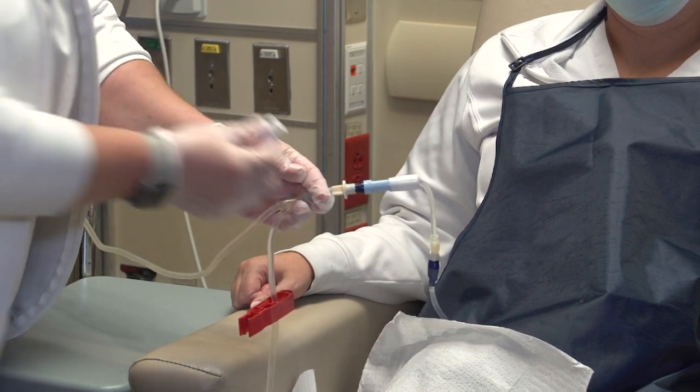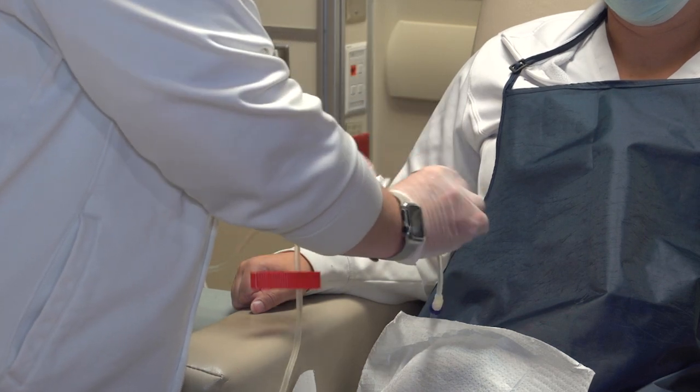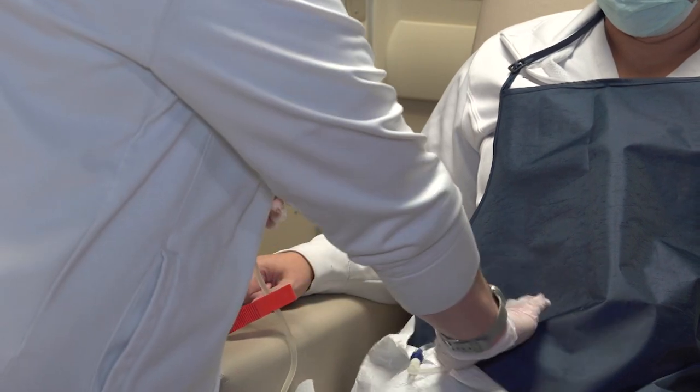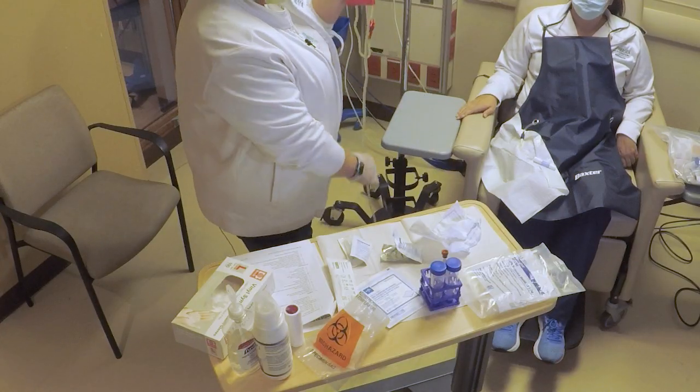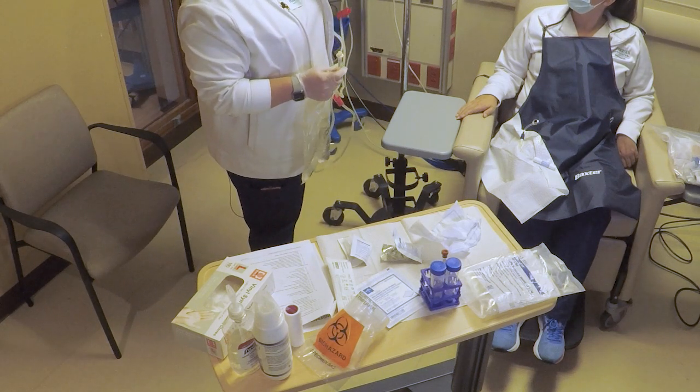Get your mini cap. Remove the ultra bag. Replace it with your mini cap. Tape it per the patient's comfort and let that dwell for 2 hours. The rest of this solution can be discarded.